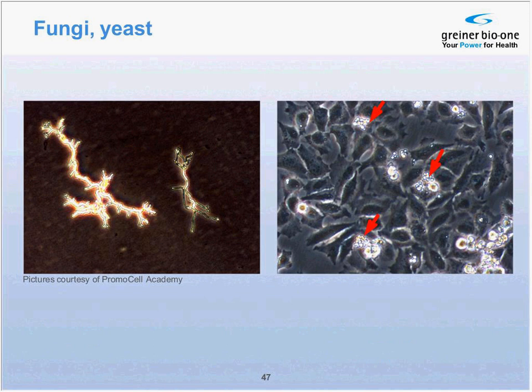Fungi become apparent in the cell culture by the appearance of hyphae, as you can see in the left picture here. Besides cells, laboratory equipment such as the water bath can be afflicted with the appearance of fungal flakes. Fungus causes the medium to turn basic, in contrast to the acidic medium that applies with bacterial contaminations. Yeast, which is a subclass of fungus, can be identified by the occurrence of small groups of round or oval yeast cells, such as shown in the picture on the right by the white structures.